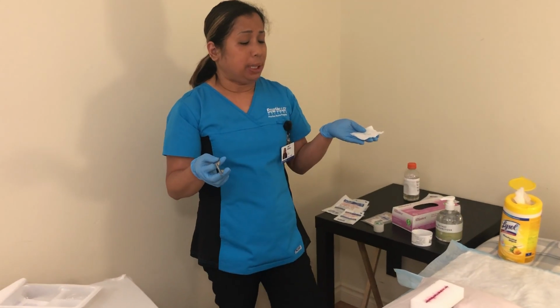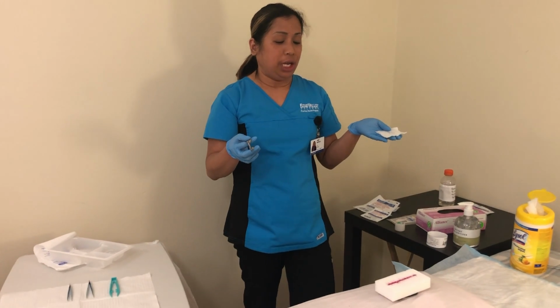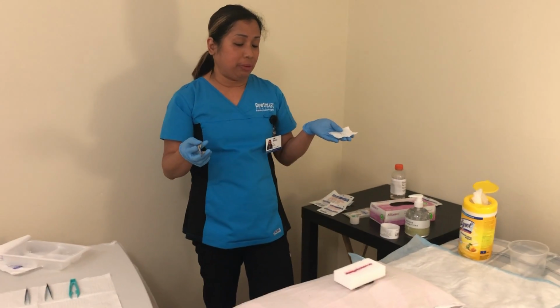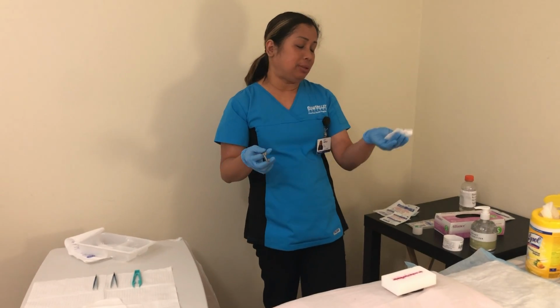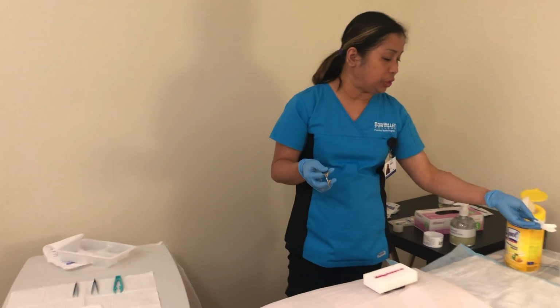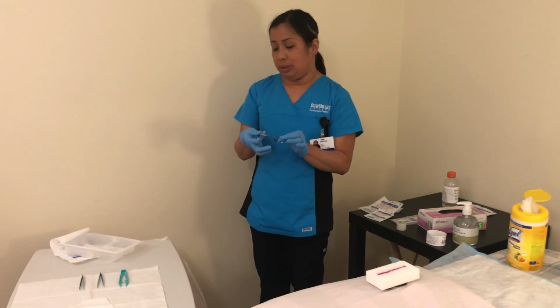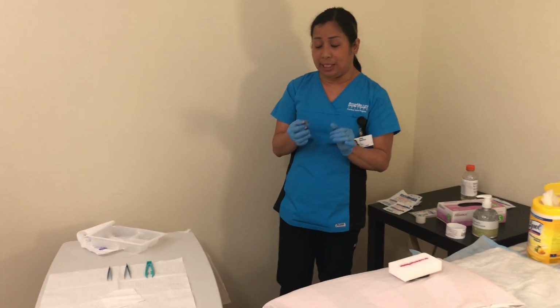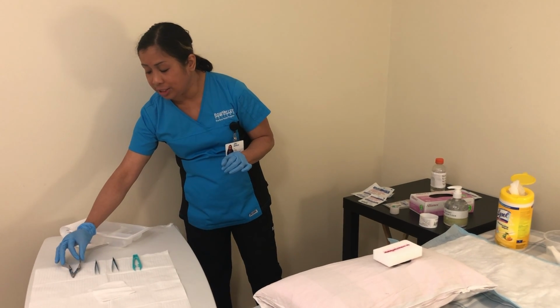Hi Michael, by the way, you still have 3 staples remaining in your wound, and they will be removed tomorrow. He said yes. Now I'm going to discard these in the sharp container. This one, just in case I still need it later, I'll put here at the bedside.